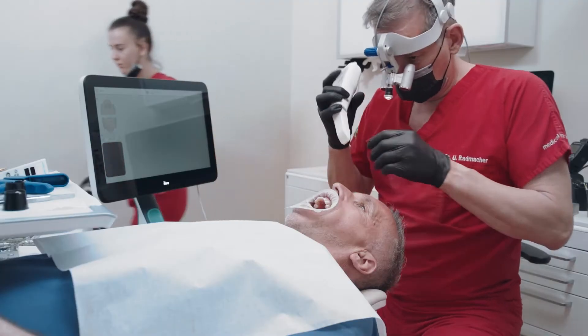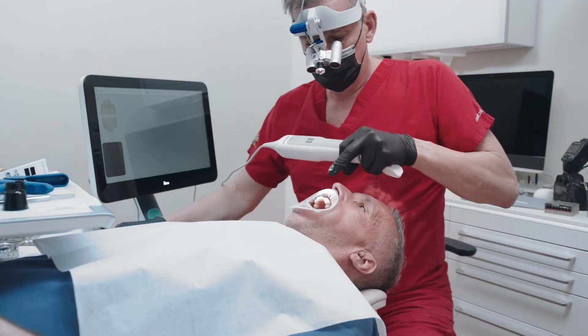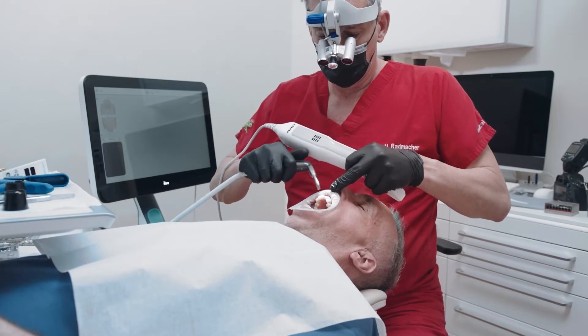After a full exam, Dr. Radmacher proposed a chairside implant and crown to restore his patient's smile.